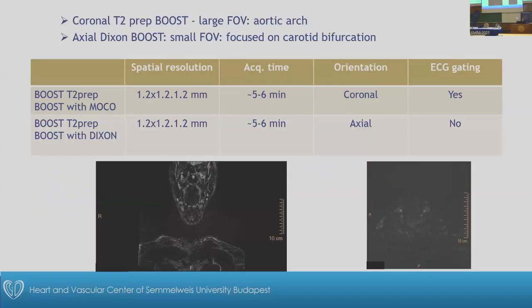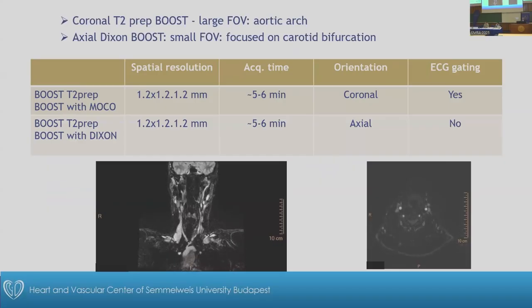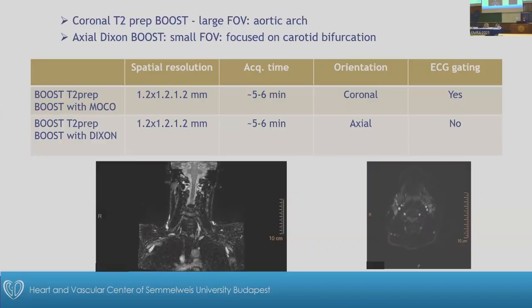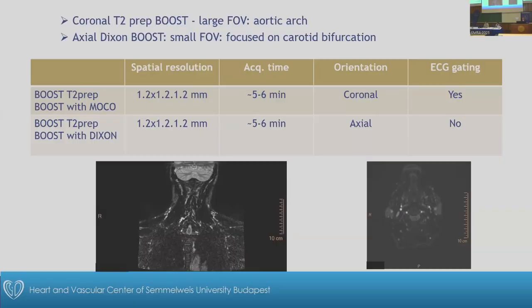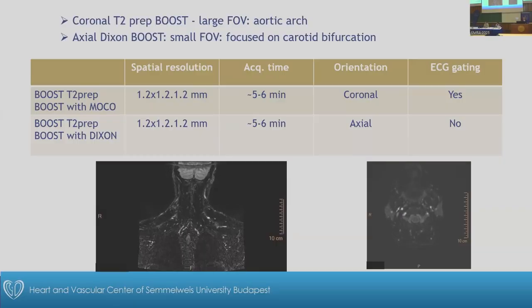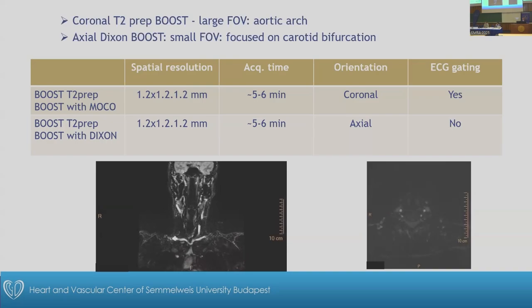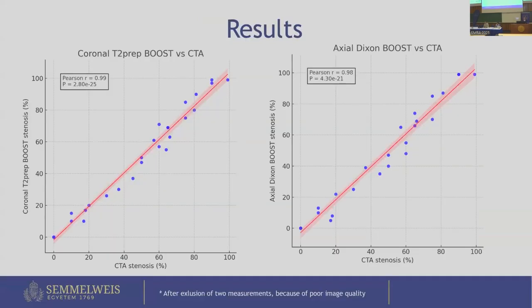Here are our protocols. The main difference was the larger FOV with the T2 prep BOOST MRA technique, and we used ECG gating there. But with the axial Dixon-based BOOST, we used a smaller field of view and no ECG gating. So these are our results.